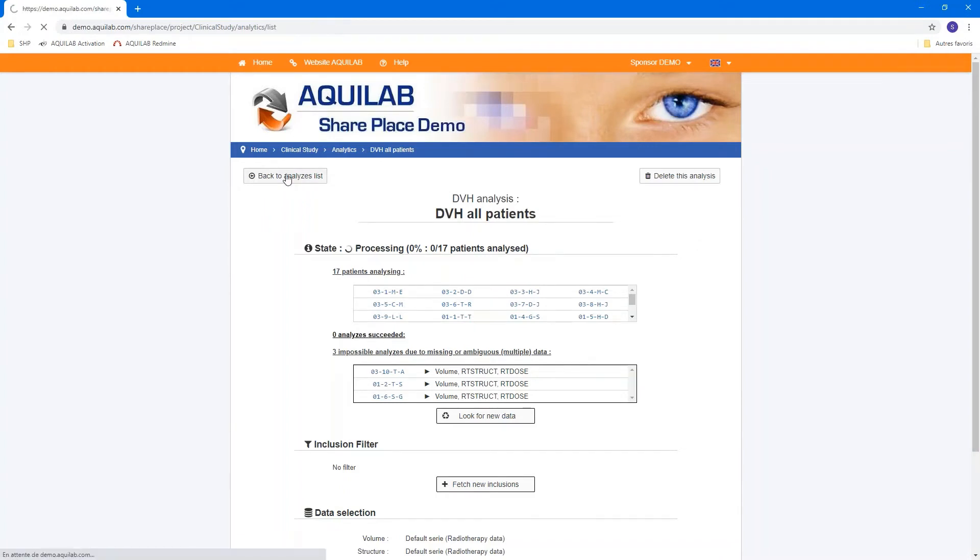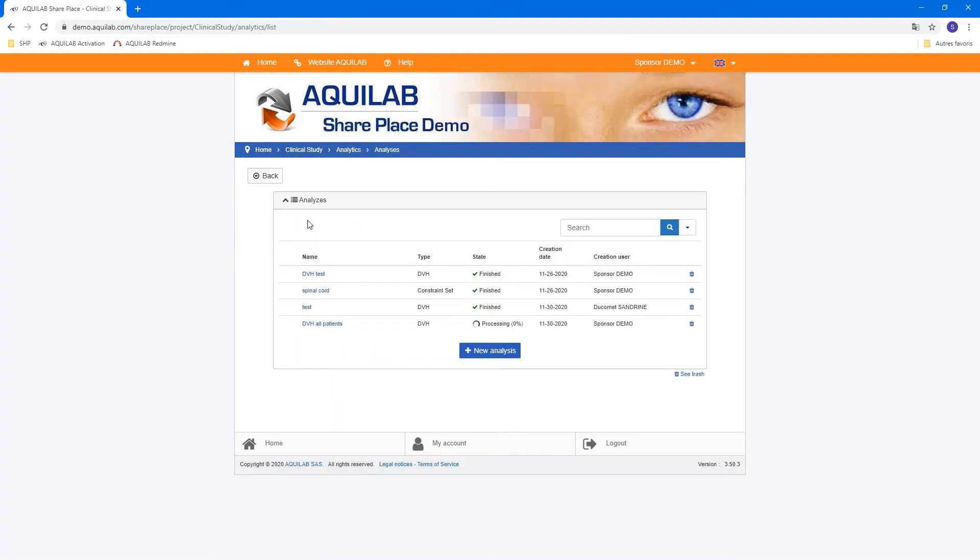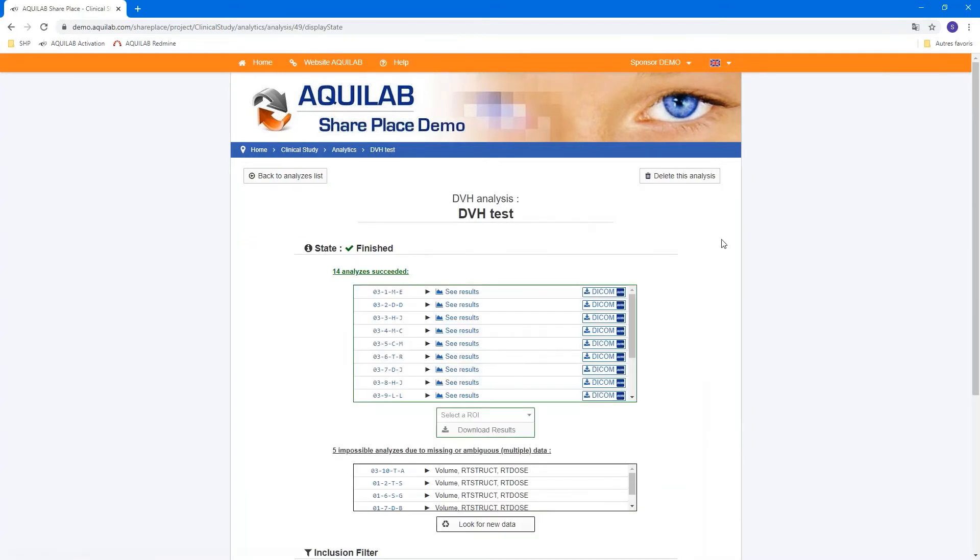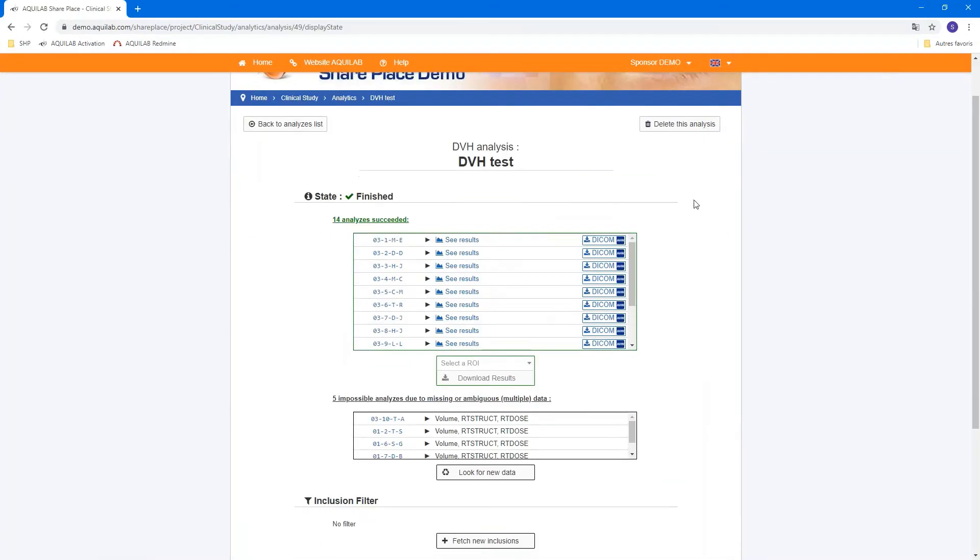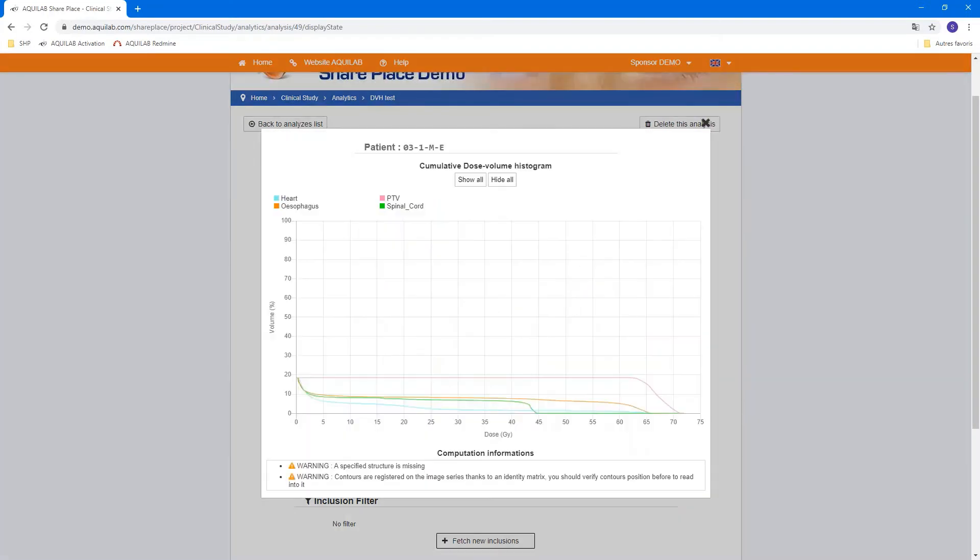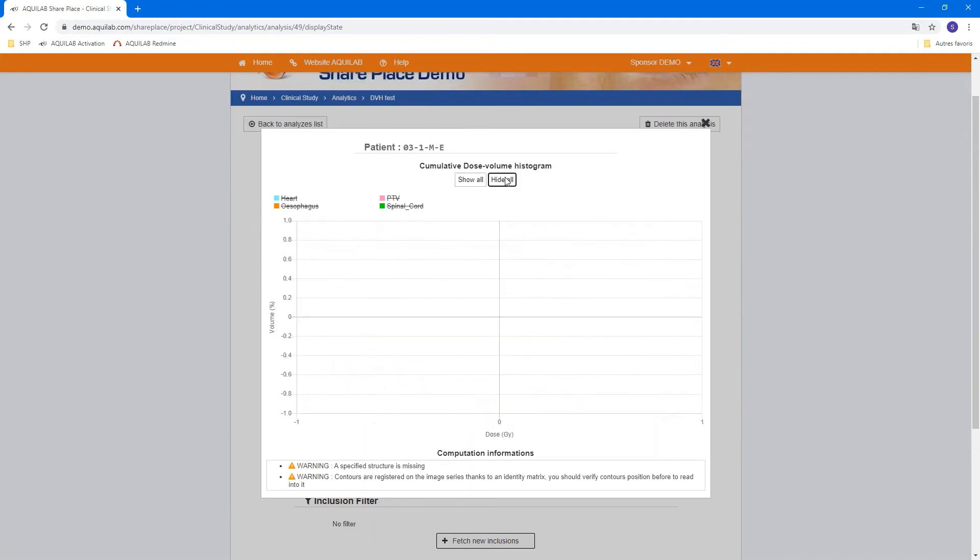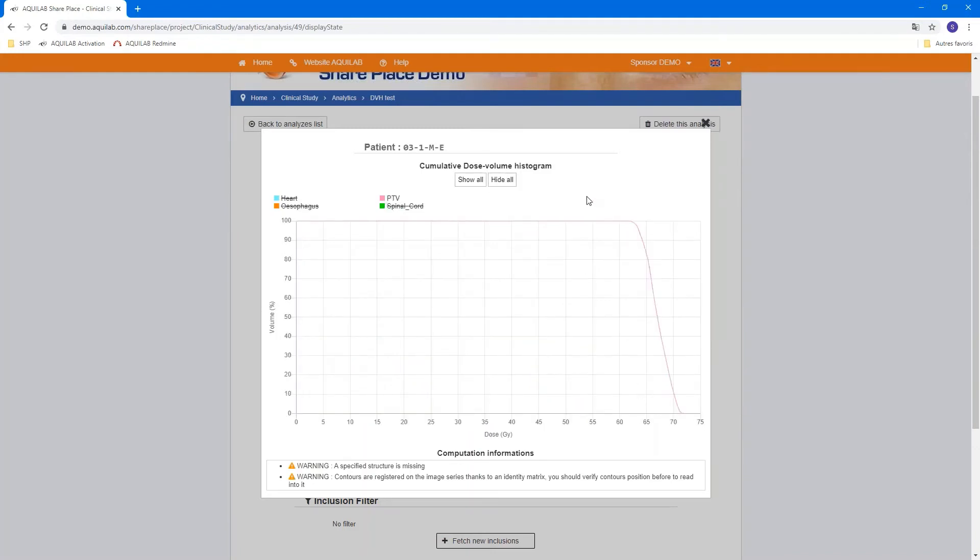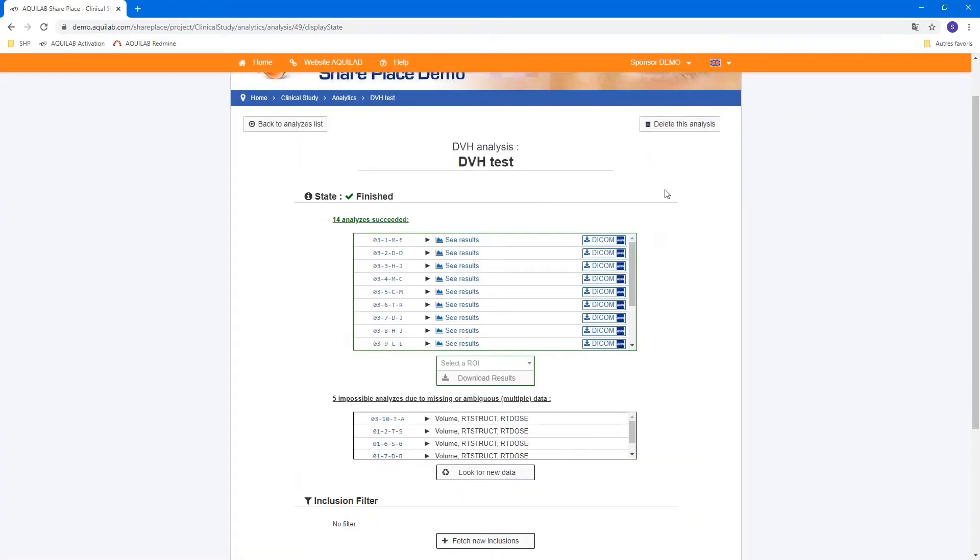This analysis is processing. We can go back and see a finished DVH test to see what the result looks like. You can see here fourteen analysis succeeded. And you can access all patients and see results. And see the DVH by patient.